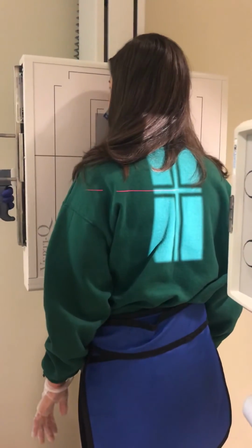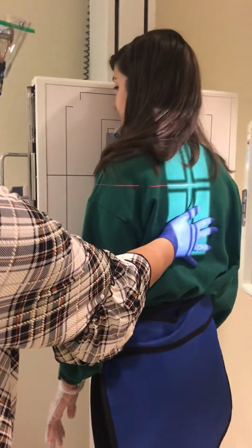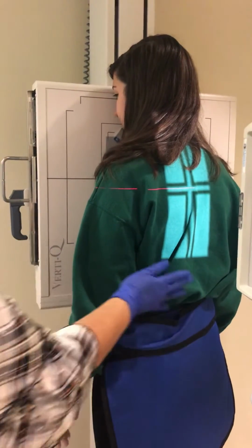I will then line up my Wall Bucky, 15 degree. We've got the shield back behind her this time to help shield the gonadal area.